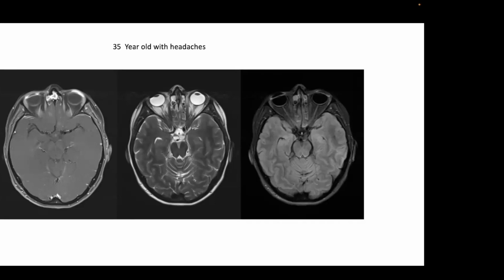So in terms of preparing patients for imaging, I try to get these people involved in scheduling or preparing the patient, especially if we're doing an orbit examination, to have them take their eye makeup off, because this distorts the globe to the degree that I think you lose some of your sensitivity to disease. But don't mistake this for pathology. It has an artifact look to it, as you mentioned. It doesn't seem real, but it does look odd. This is just from eye makeup.